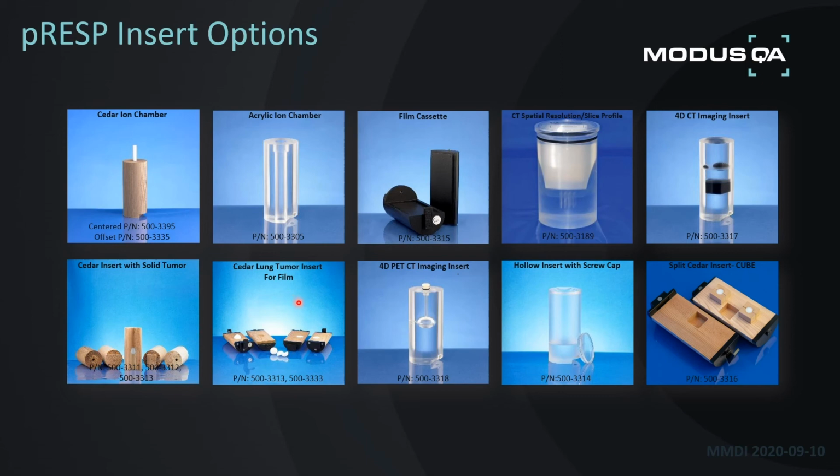And we also have a split insert where you have a tumor model within it. You can place a piece of film for dosimetry, and then you're planning a treatment to that actual volume and verifying it with your motion protocols. This is the same PET-CT insert that I reviewed earlier. And again, used for radio tracers or any other liquid you wish to place within that volume. We have a hollow insert, and this one is designed to place liquids in there or any mini phantoms or devices you want to use as part of your tracking.